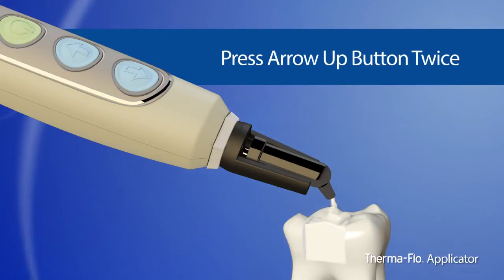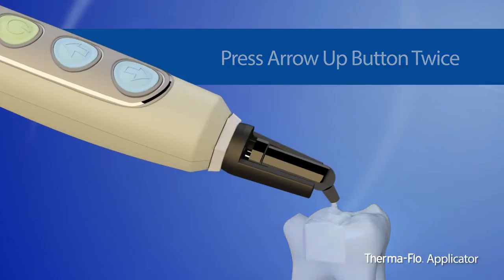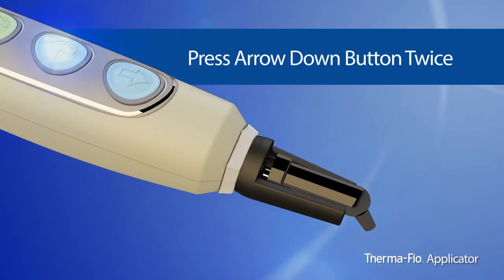When the capsule is empty, press the down arrow twice and the handpiece will automatically retract to a ready-to-use position.